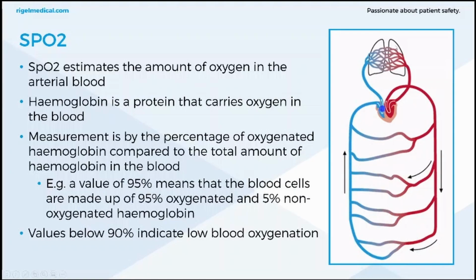If you're getting oxygenated blood via your lungs, that means that the heart and the lungs are both performing as they should. The cardio-respiratory system is behaving correctly, and if SpO2 values start to reduce, then that's a sign that either the lungs or the heart have stopped performing well. That was again highlighted within COVID-19. SpO2 monitors were becoming more commonplace, even the cheap handheld SpO2 ones that were being sold were there as a sign to see how well your lungs were performing.